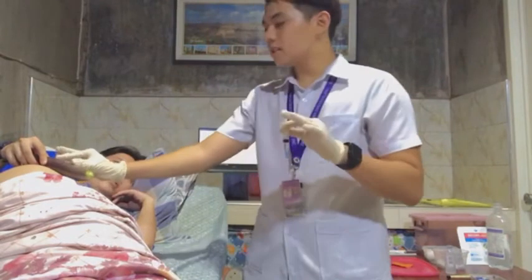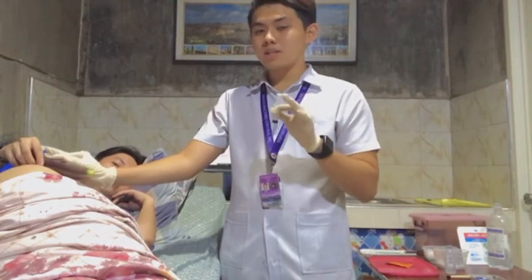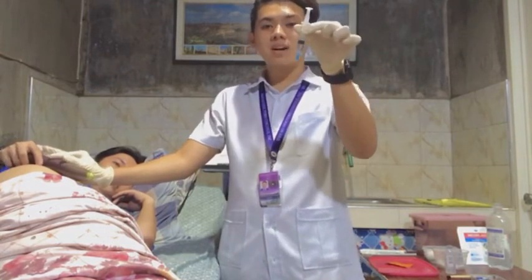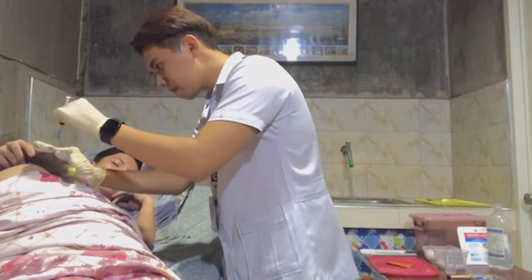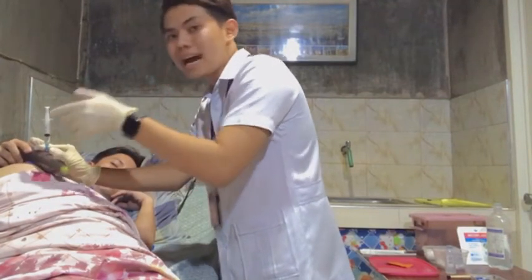With your dominant hand, we will be quickly piercing the muscle at a 90-degree angle to the skin, continuing to pull the skin taut with your non-dominant hand. After that, we will be aspirating.